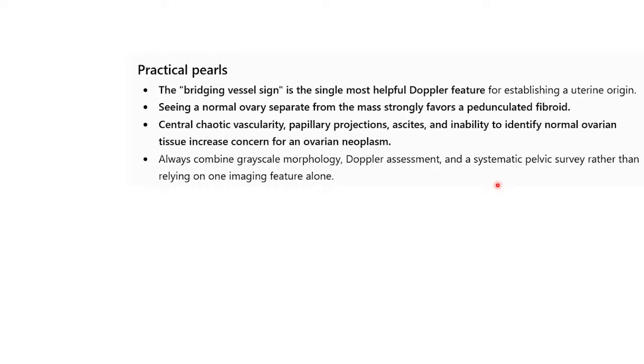where we are going into the depth of ovarian masses, how to differentiate them, so that we don't cause unnecessary panic, we don't cause unnecessary expenses, we also don't have to cause unnecessary complications to the patients.